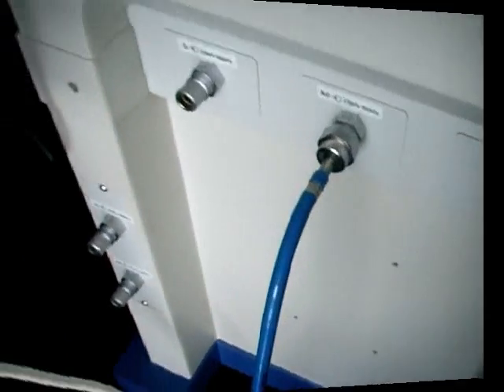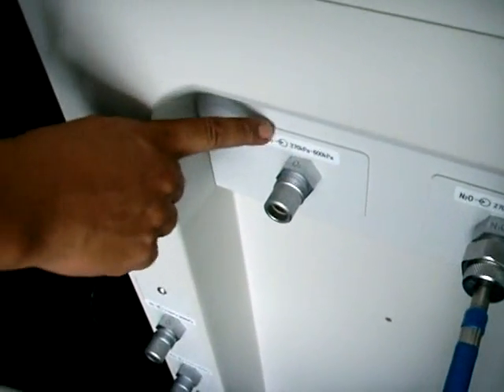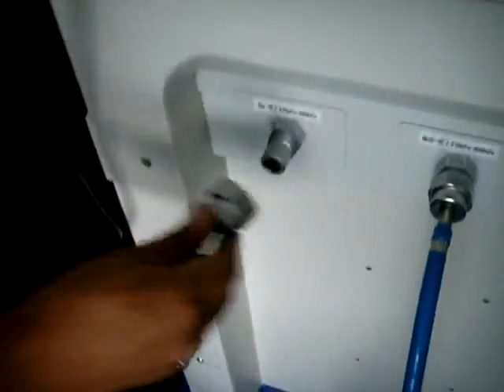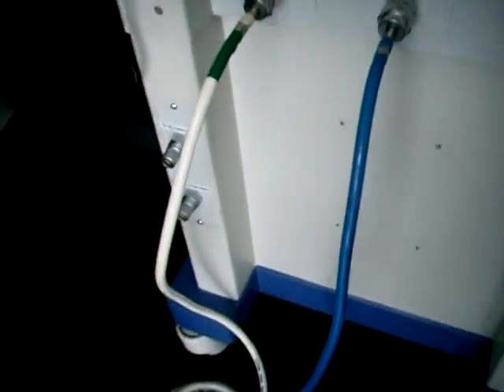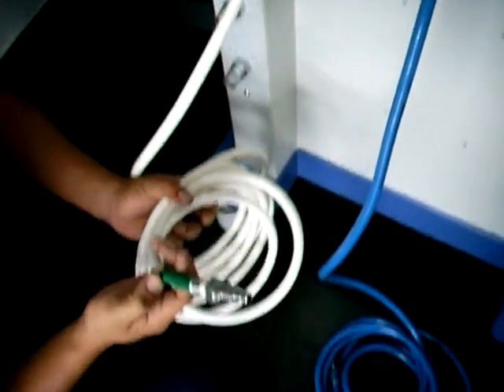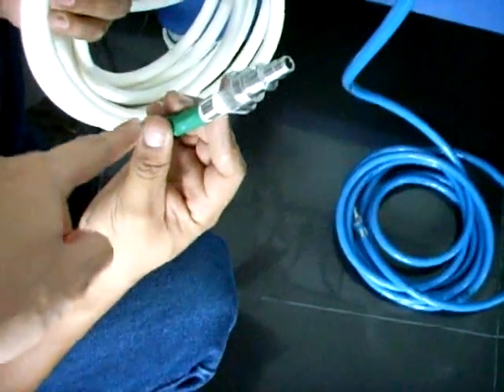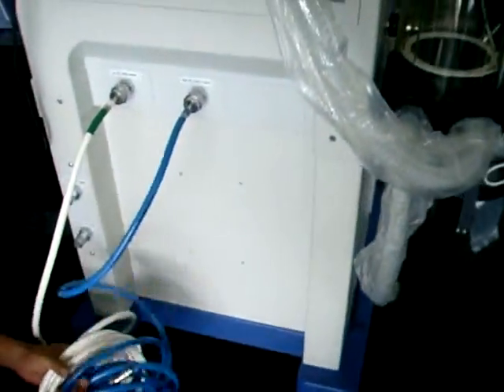Procedemos a hacer la instalación de las mangueras a la máquina de anestesia. Observamos que cada una de ellas se encuentra previamente identificada con las siglas de un gas, sea oxígeno u óxido nitroso, que deben coincidir con el conector etiquetado en la máquina. Aseguramos que queden completamente conectadas al equipo. Es importante aclarar que la compañía no entrega los acoples finales, debido a que cada institución de salud tiene sus respectivos acoples, los cuales deben ser instalados en la parte final de las mangueras de cada gas.